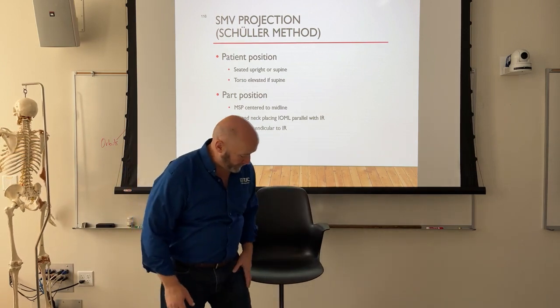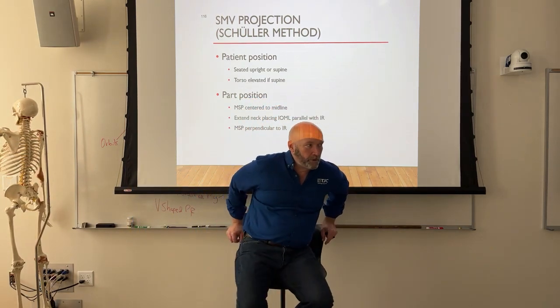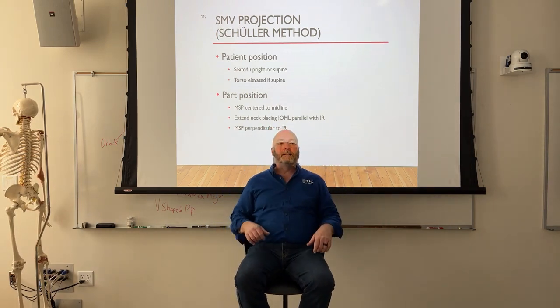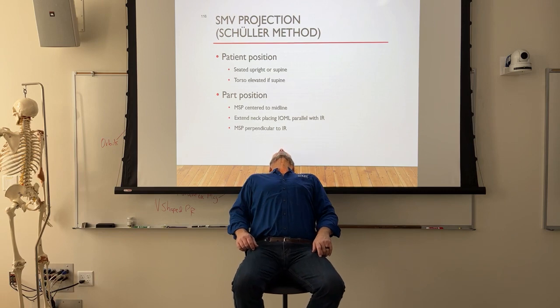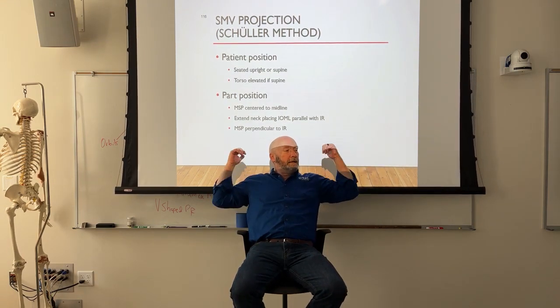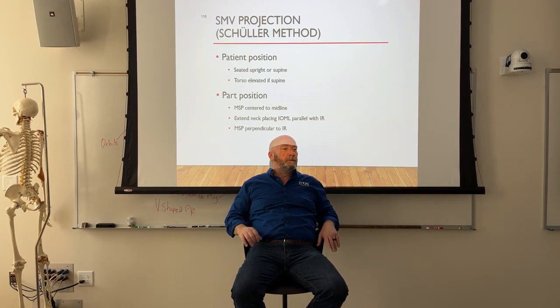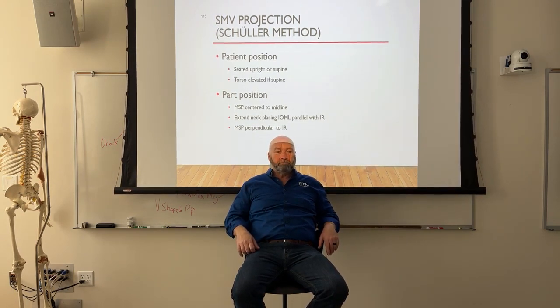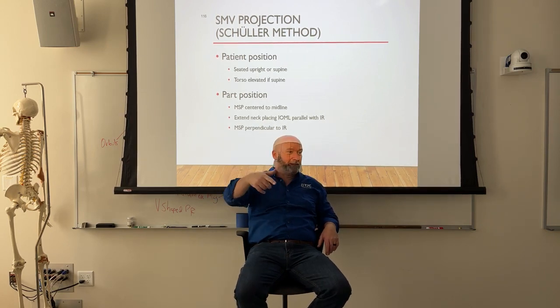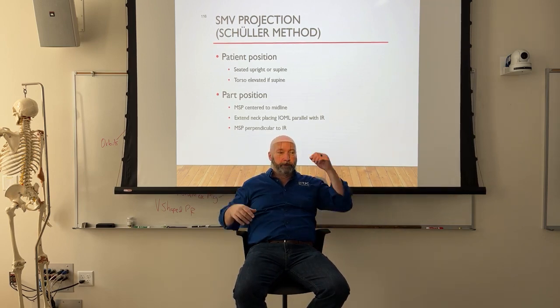But let's say you put the patient on one of those roll-around stools, and you have them lean back, and they put their head on the image receptor. They're leaning way back like this. They don't have a back on the chair because it's a stool, right? What's going to happen? Well, you were doing sinuses, now you're doing skulls, because the patient's going to fall off the stool. It's going to roll right out from under them.